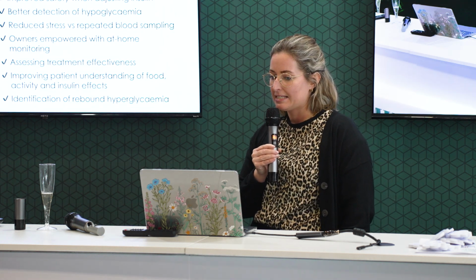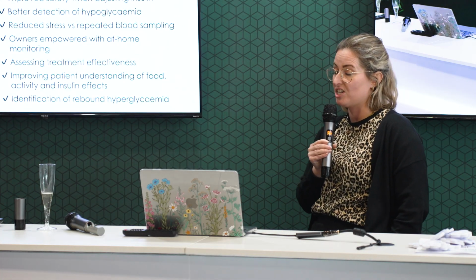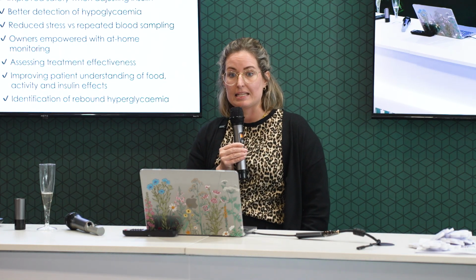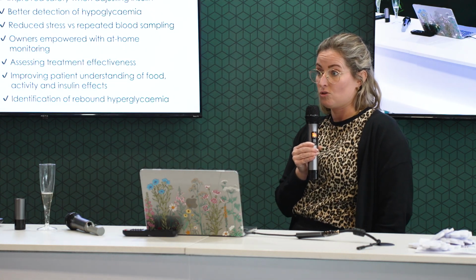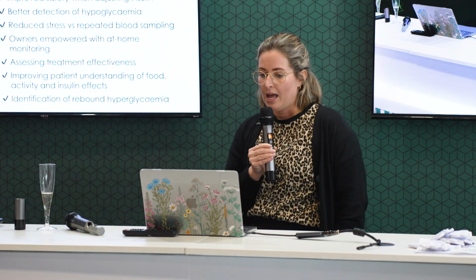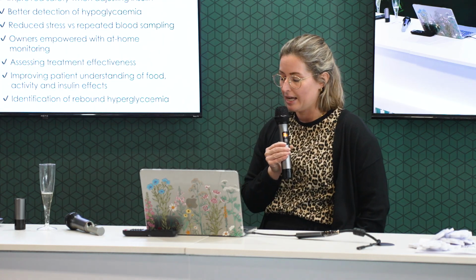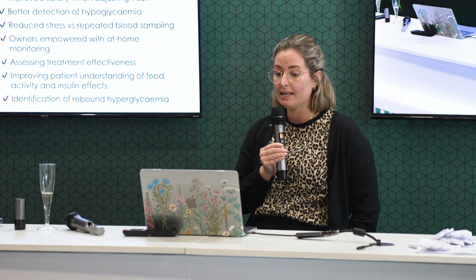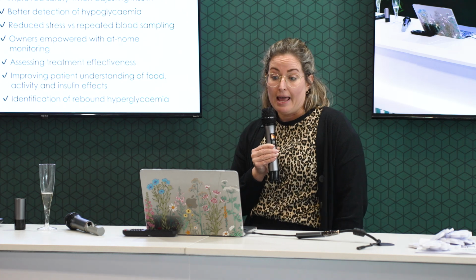Again, it's going to allow us to assess treatment effectiveness. So if we do have any of those dose changes, or perhaps we've modified the patient's diet, or maybe we've adjusted that patient's exercise, we're going to be able to look at those lifestyle things alongside what that patient's blood glucose is doing. And it's going to help us to see how those things are intertwined in affecting their glucose control. And again, if we have patients where maybe we've not quite got them on the right dose of insulin and they're at risk of hyperglycemia, it is going to help us out in those patients as well.